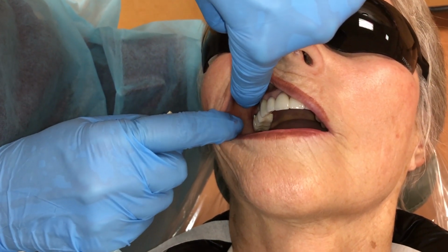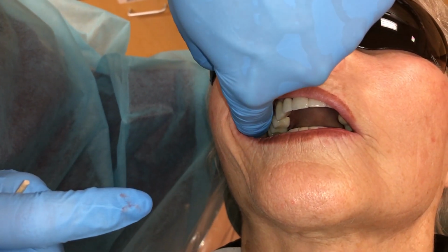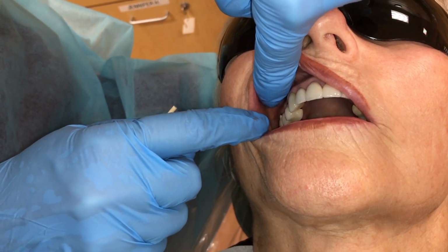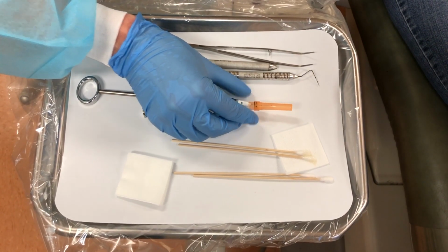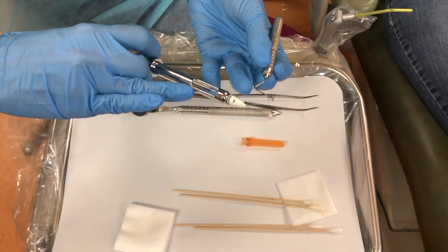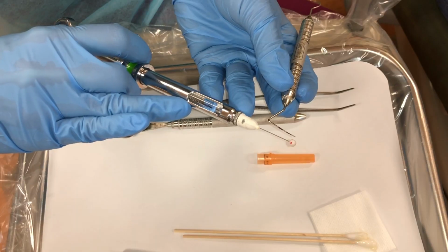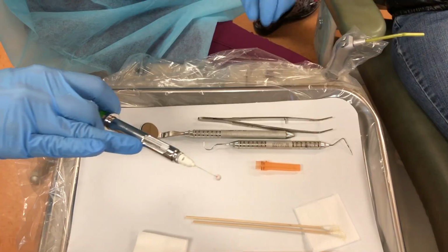For both the MSA and PSA, it is helpful to run your index finger along the zygomatic process to confirm its location. A probe can be utilized to identify the depth of penetration for the MSA injection, which is approximately 3 to 6 millimeters. Studies have reported the absence of the MSA nerve branch in somewhere between 50 to 72% of individuals. This may require you to utilize additional local anesthetic for pain management.